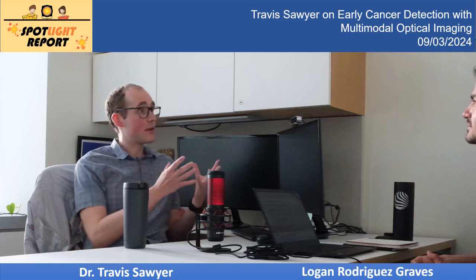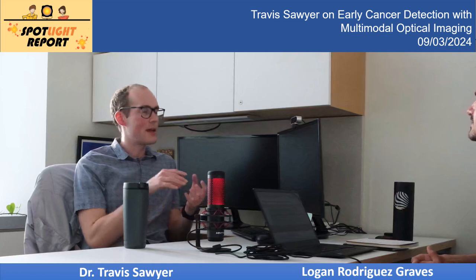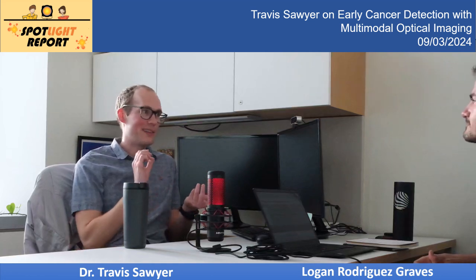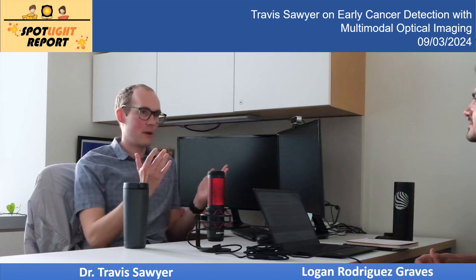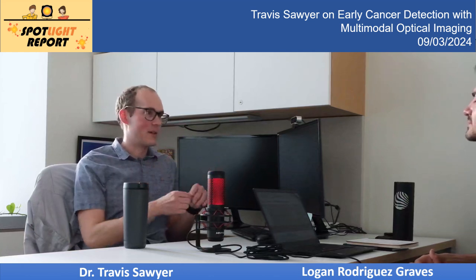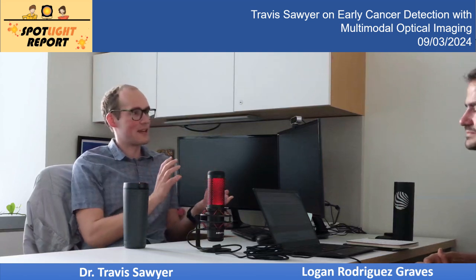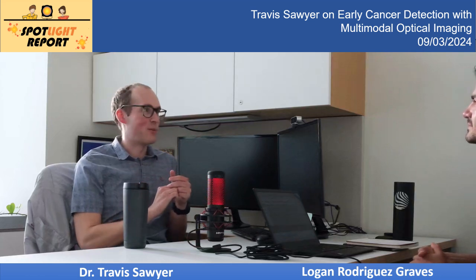In biomedical optics, I think it really is this idea of cramming as much as you can into a tiny little space and trying to get as much information as quickly as possible. So you might not need the best resolution possible. Let's say the diffraction limited resolution is 5 microns, maybe you're okay with 10. But those other things tend to be the real headaches that require 90% of the work.